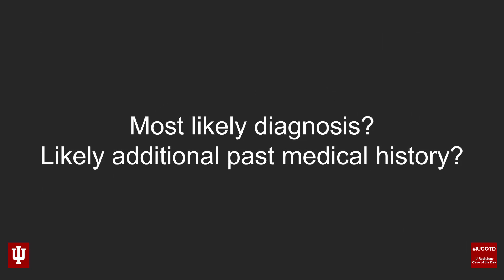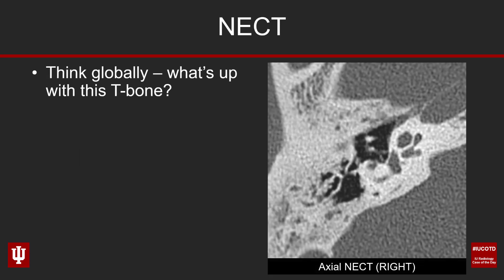What is the most likely diagnosis and what additional past medical history has this patient almost certainly had? Let's take a look at the imaging. First up, we're looking at the patient's right side — the abnormal side, the side with conductive hearing loss. At first, nothing may really jump out as abnormal, and that's okay — that happens a lot when looking at temporal bone CTs. I like to think globally: what do you make of this temporal bone? Does it look normal, or does something seem to be going on?